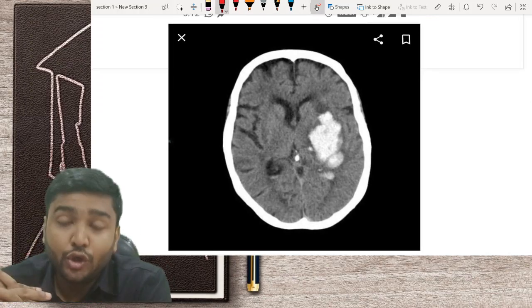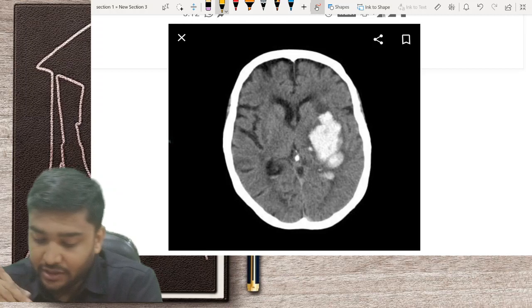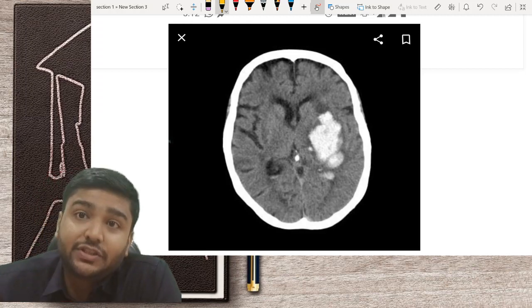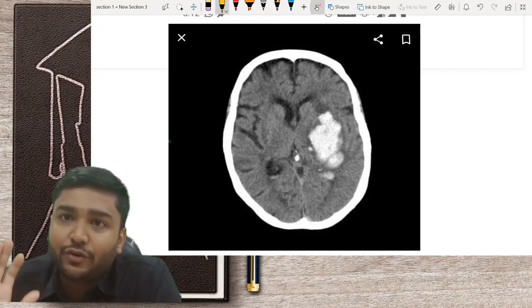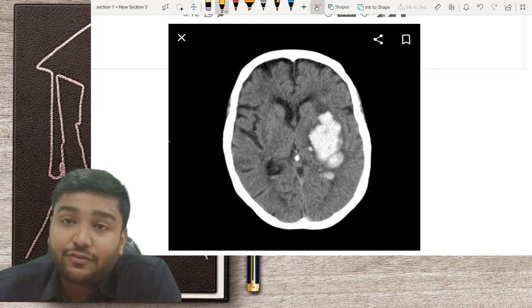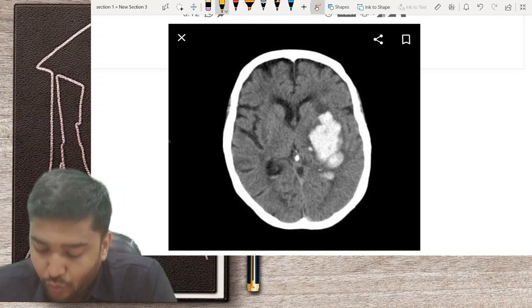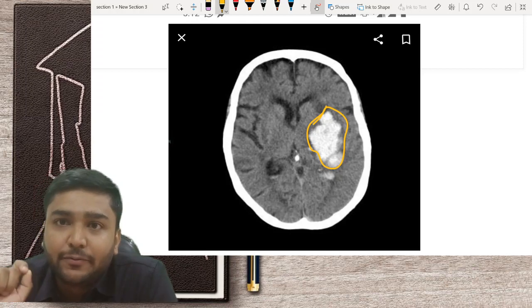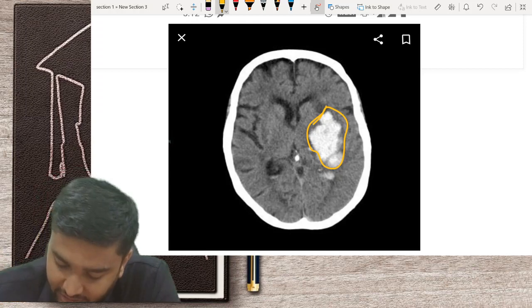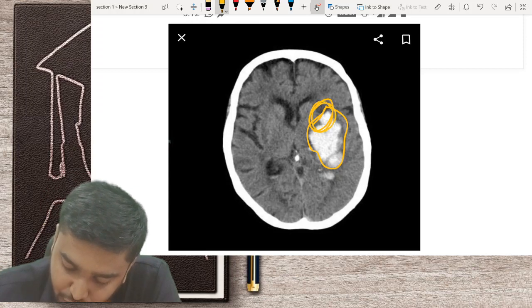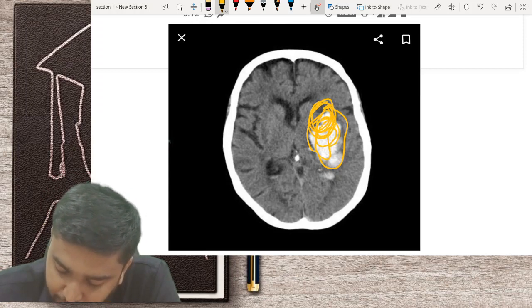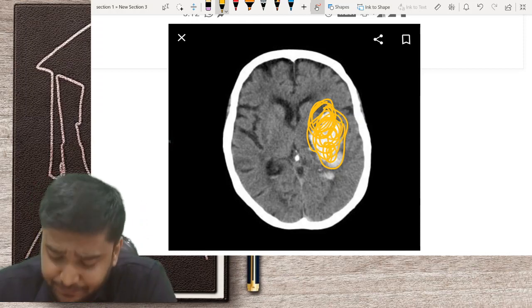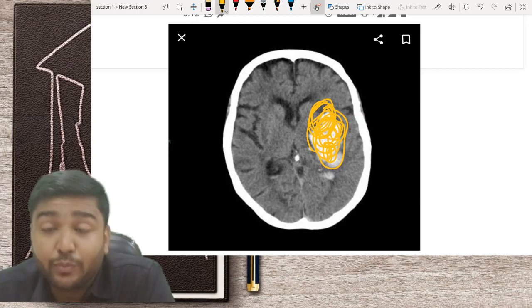Moving to non-traumatic bleeds, also called spontaneous bleeds: this is a typical CT of hypertensive bleed. The patient will clearly say they stopped taking their hypertension medicines for three or four days and then developed right-sided paralysis. This is a very typical site of basal ganglia bleed — the most common site is the putamen, in the internal capsule area. The patient will have contralateral hemiplegia and ipsilateral pupil change if there is uncal herniation.